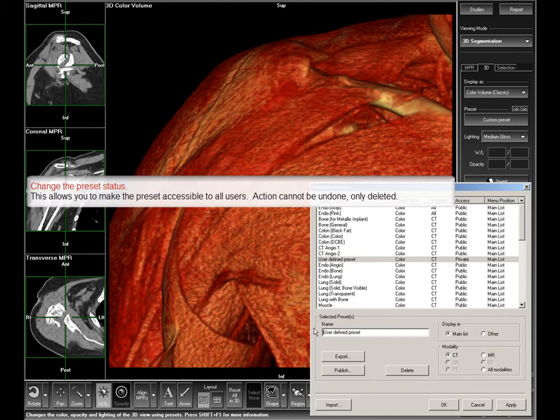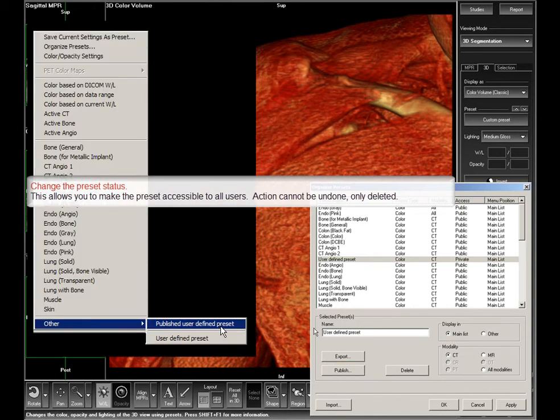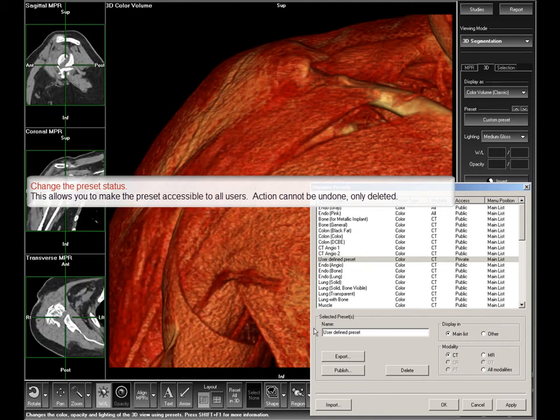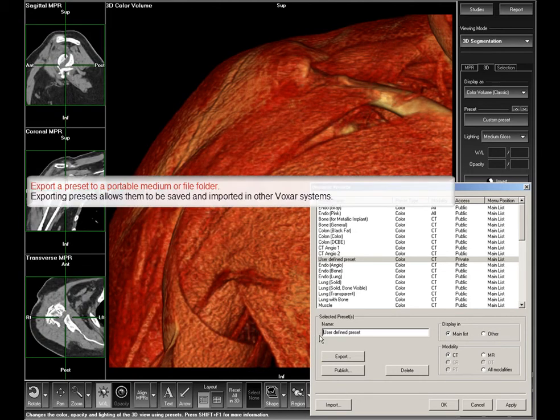In order to make a custom preset public — that is, available to other users — you can select Publish. This will move your private custom preset to the public list, visible for all other users. It is not possible to unpublish a custom preset, only delete it.